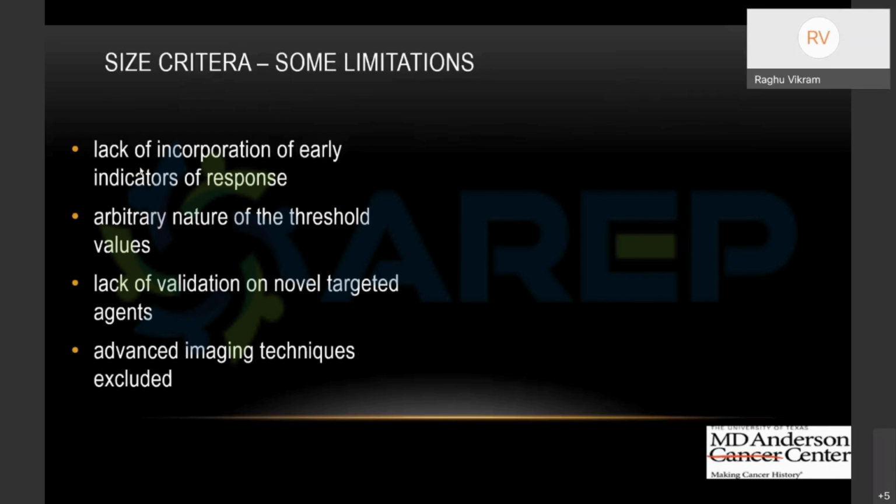Why? Because when we looked at the chemotherapy, we talked about VEGF inhibitors, which are anti-angiogenic. So it decreases the enhancement and stuff like that. Those kinds of findings are not incorporated in the RECIST criteria, or nobody uses WHO anymore. But anyway, the RECIST criteria. And so some people started questioning, is it good to use it?